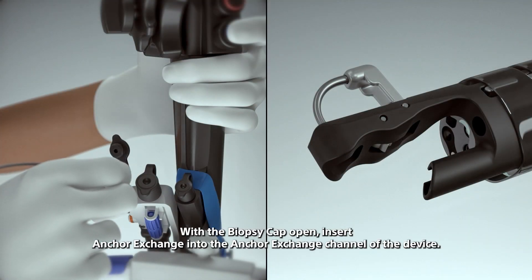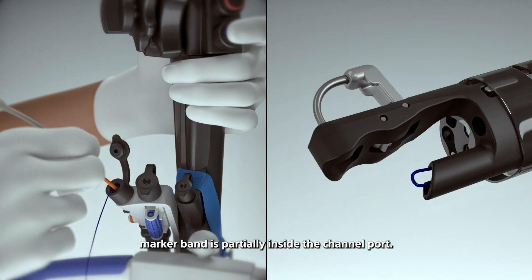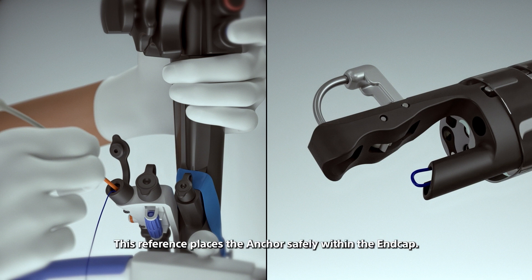With the biopsy cap open, insert anchor exchange into the anchor exchange channel of the device. Advance anchor exchange catheter until the orange marker band is partially inside the channel port. This reference places the anchor safely within the end cap.